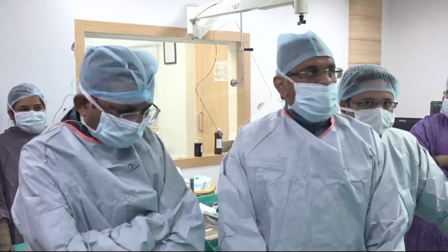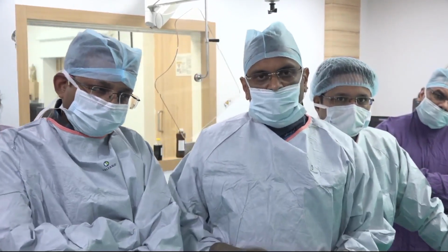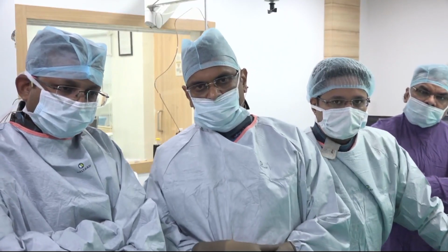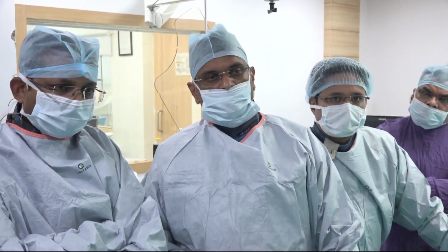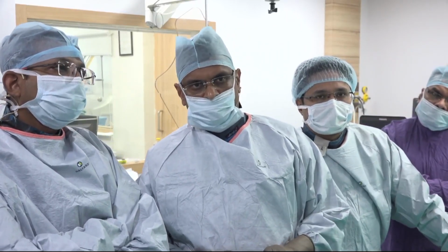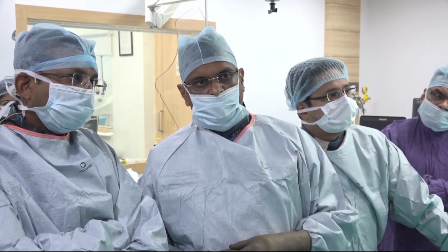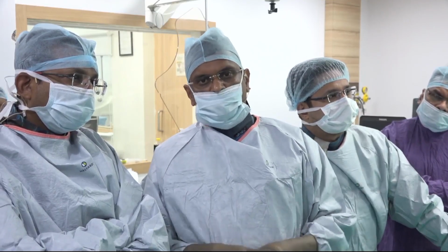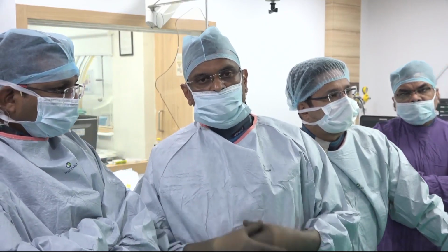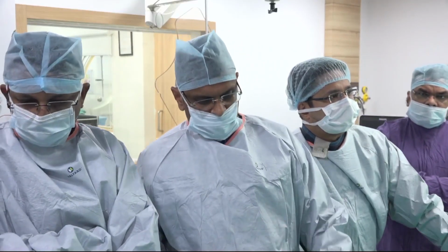Please tell. So we all agree that TAVR would be a better choice for this patient: 75 years old, heavily calcified anatomy, once subdural hematoma, already a high risk for a second surgical procedure. Now, if you look at the CT of this patient, we all agree that the annulus is more than 26 millimeter, LVOT more than 26 millimeter, and the supra-annular measurements are also equivalent to or more than that. That means it's a tubular kind of anatomy. If it is tubular anatomy, then we need to size the valve as we size tricuspid valves. So anything above 26, we are going to take a 34 millimeter valve.